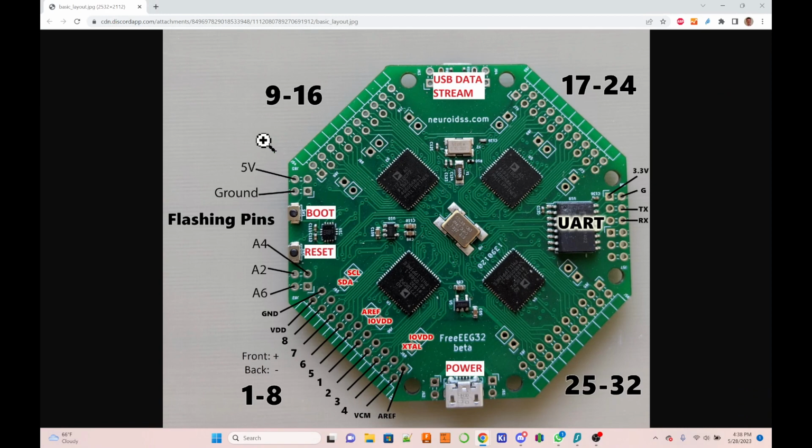Yeah. So here we have the board, and there's one key difference comparing this to the OpenBCI Cyton. And there's a few pins that we need to sort of understand. So on the OpenBCI Cyton, there's the channels, and then there's the SRB2 and the bias pins, right? And so how do we compare that to the pinout that we have on the FreeEEG32? The bias, even though it works slightly different, should be compared to VCM.